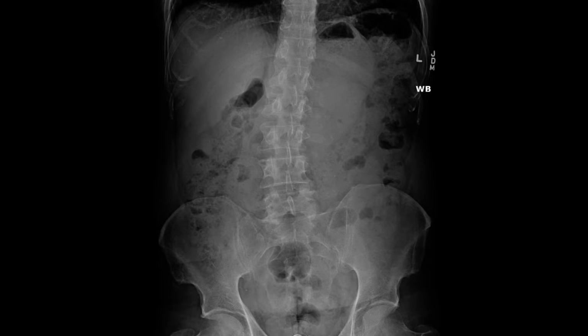If we look here at the x-rays, you notice the crest is fairly low. So it's a perfect anatomy for a right L5 transforaminal discectomy. I typically check the crest on the AP and laterals. If the crest is below the pedicle of L4, then it's usually amenable to a transforaminal discectomy.